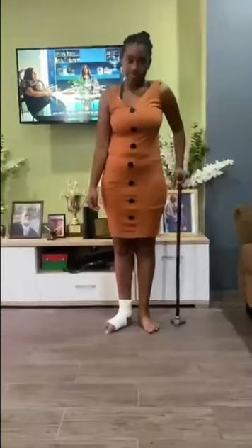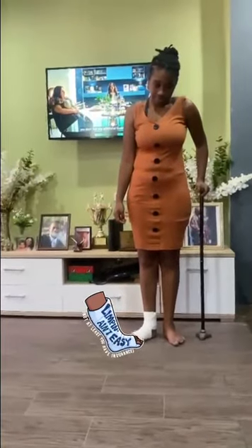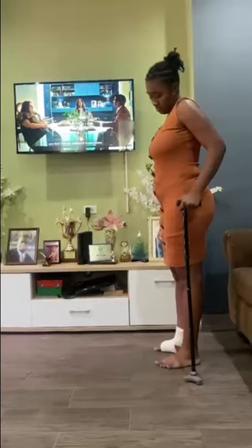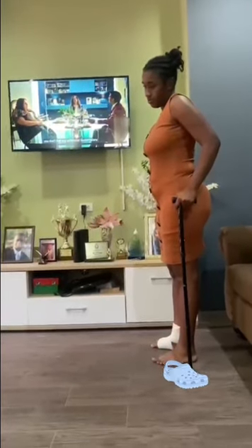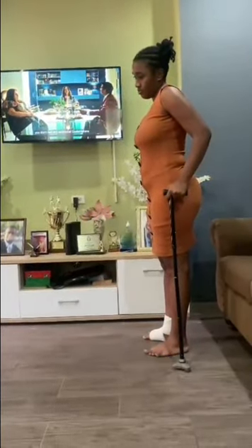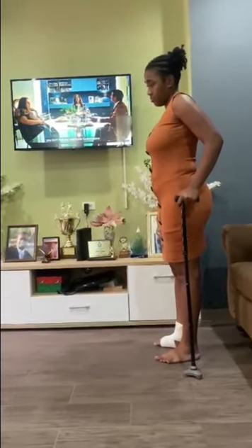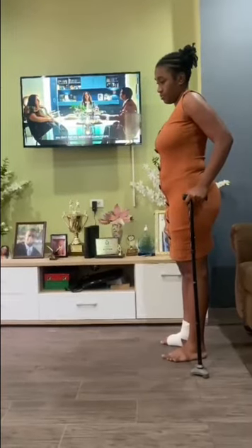So now, let's see our patient use her cane. As you can see with our client, walking with the cane, it should be parallel to the weak leg. The cane should be placed 4 inches at the side of the foot. Usually, you would ensure that your client is wearing safe non-skid footwear, but she's in her home and she prefers to be barefoot. Now, our client needs to go answer her door, so she will be walking with her cane.